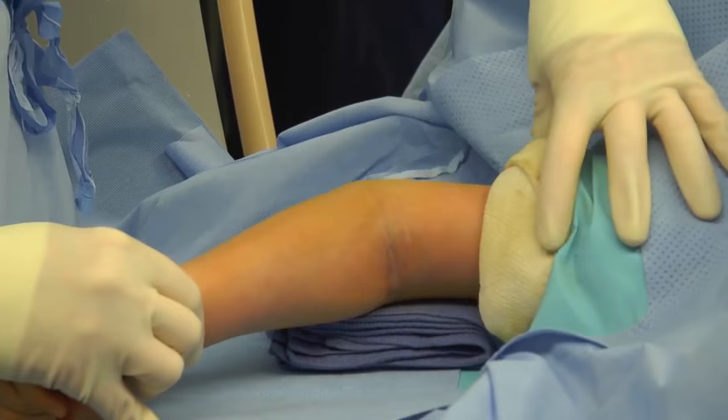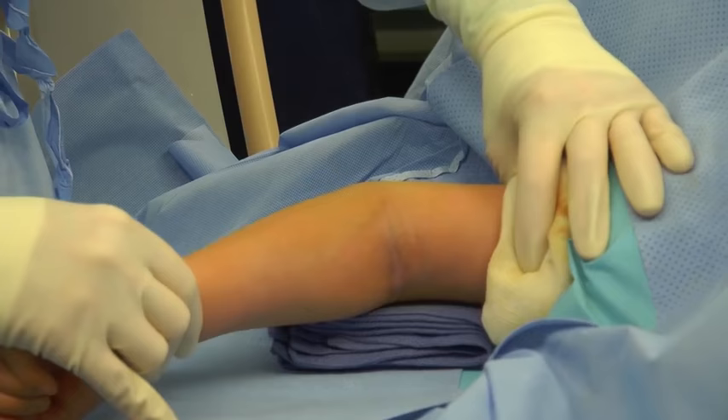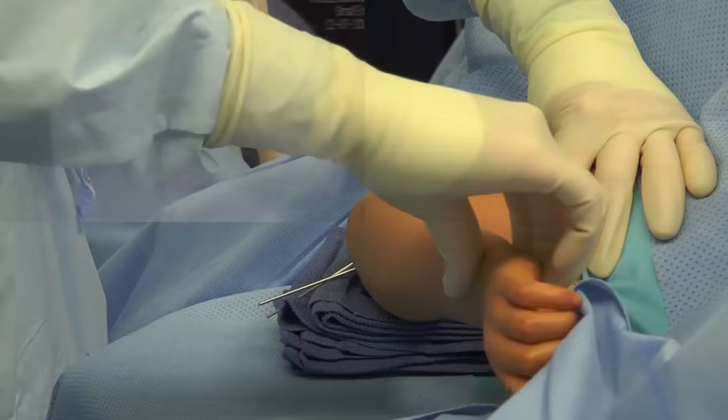Next, the surgeon can grasp the upper humerus as well as the forearm and under live fluoroscopy assess for fracture stability. If the fracture site is seen to move, a third pin may be required.